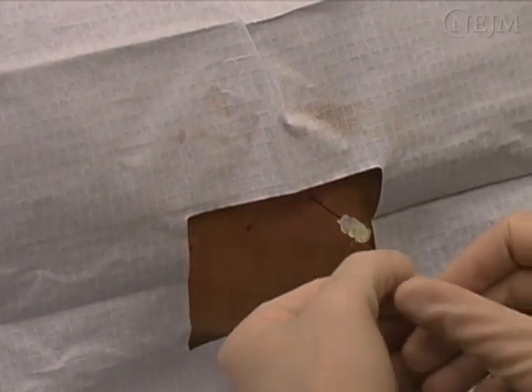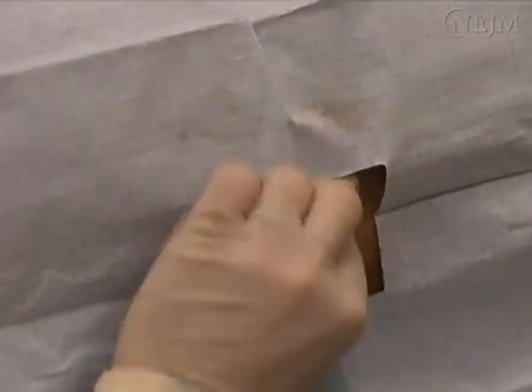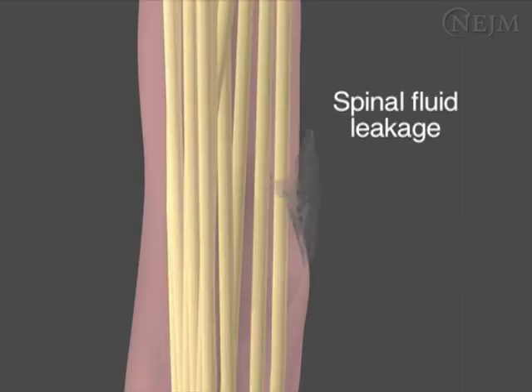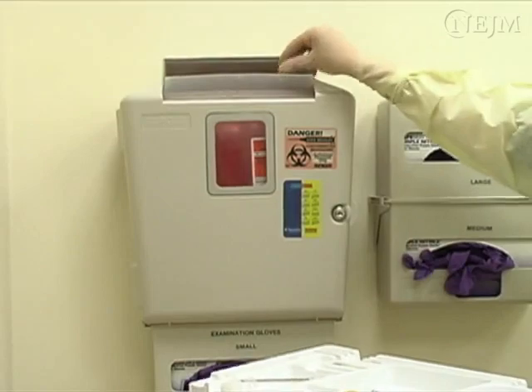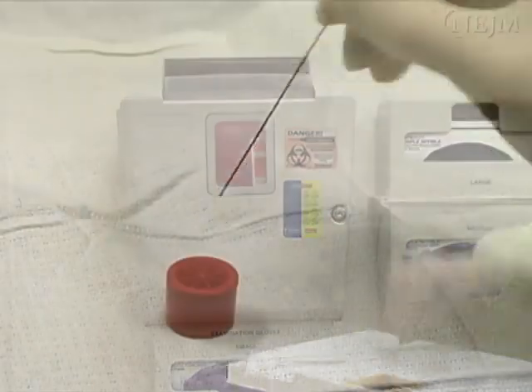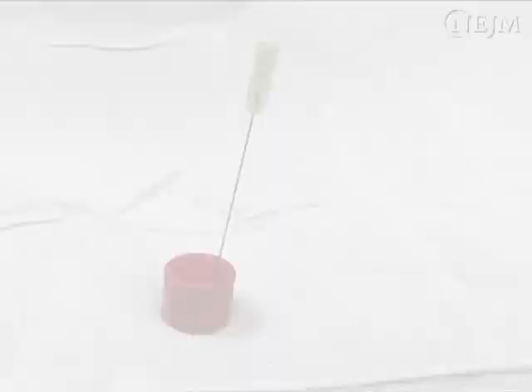After collecting an adequate specimen, replace the stylet and remove the needle. Although traditionally patients have been told to lie flat for several hours after a lumbar puncture, there is no evidence that this precaution decreases the risk of a cerebrospinal fluid leak, post-puncture headache, or other complications. All sharps should be properly disposed of in appropriate sharps containers or needle lock devices to help minimize the risk of needle stick injury.